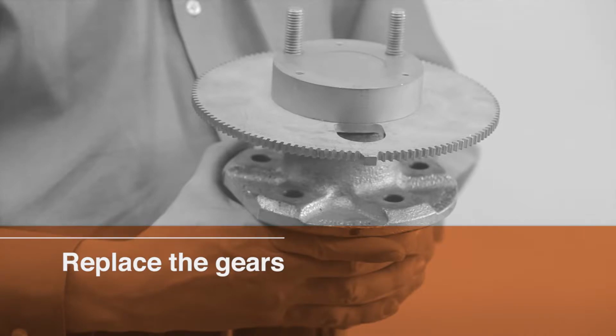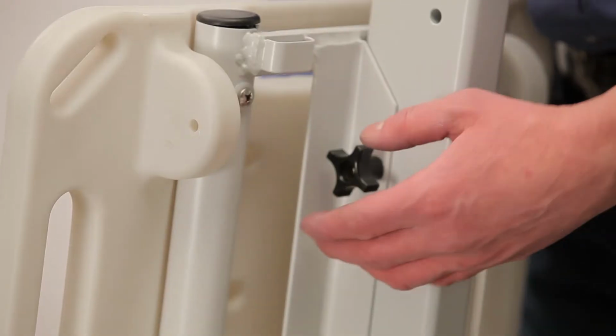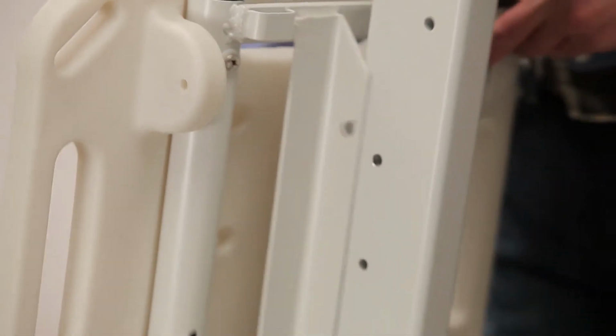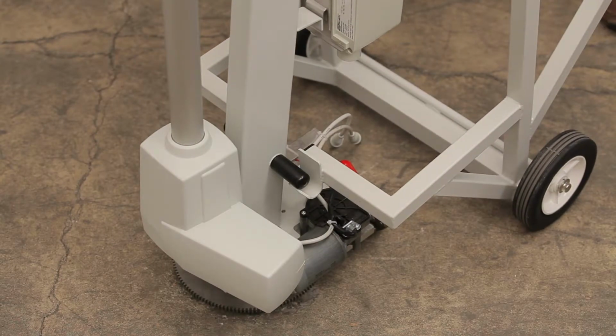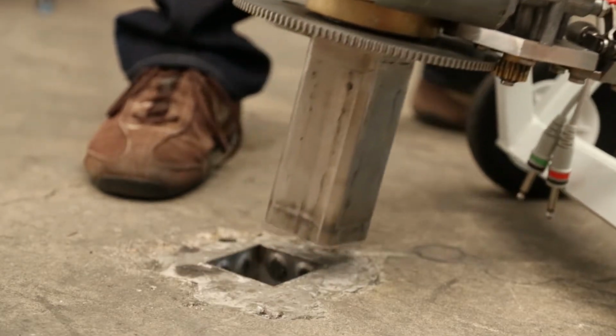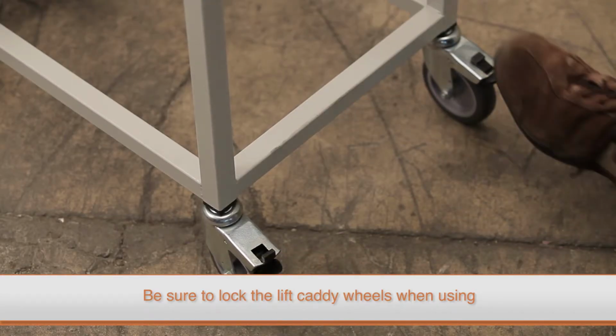To replace the gears or motor, you will need to further disassemble the lift. Start by removing the seat assembly. Loosen the thumb nut on the bolt that attaches the seat assembly to the arm. Remove the bolt, then remove the seat assembly. Next, using the lift caddy, carefully lift the aXs out of the anchor until it rests comfortably on the caddy. Be sure to lock the wheels on the caddy after lowering it to a resting position.